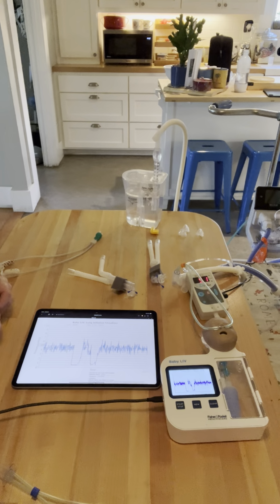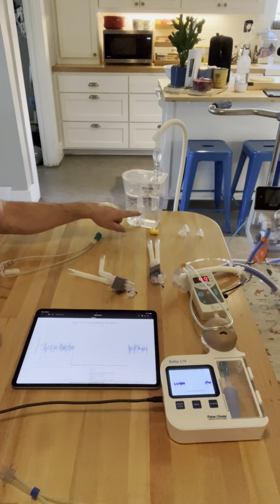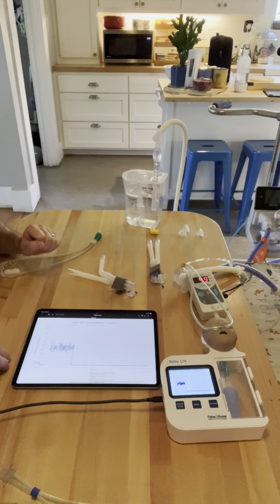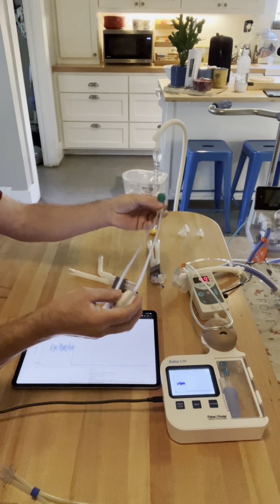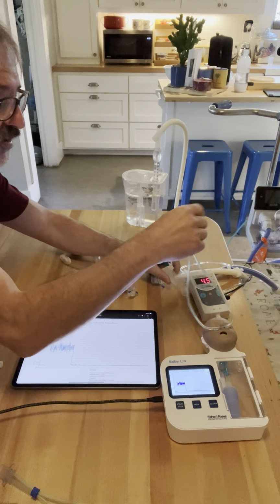But when we have the orange ram in the nose of the baby, and the pacifier is taken out, it's still bubbling. I'm showing this because if you have this on a ventilator or a bubbler, your alarm's going to be tripped. This is giving us a false reading, and that's because of the size of the tubing of the ram. The corresponding cannula to the orange ram is the green OJ2 cannula. So let's take a look at that.